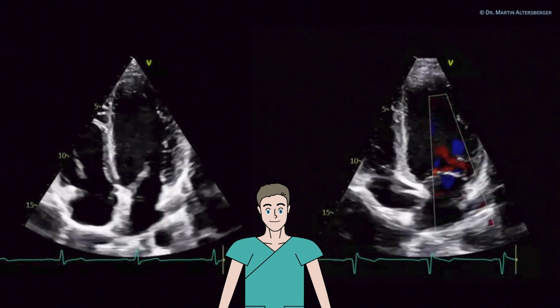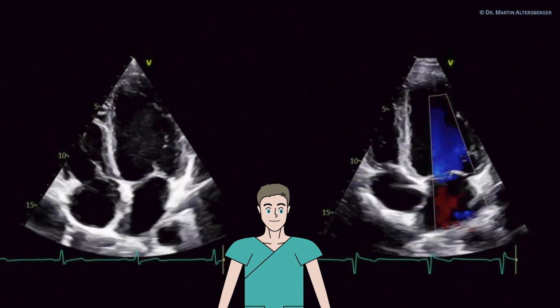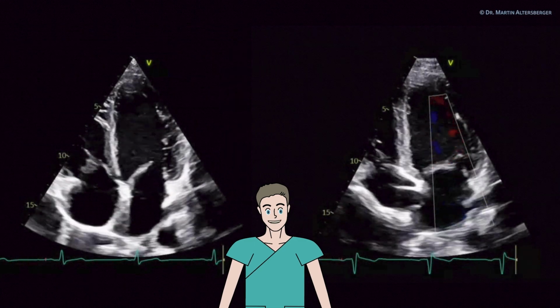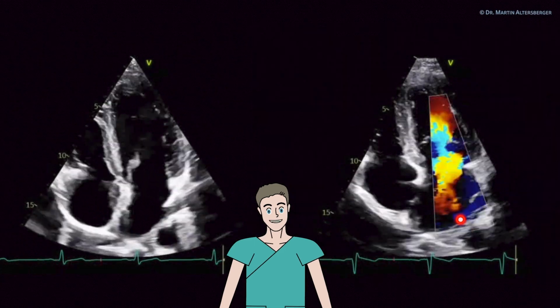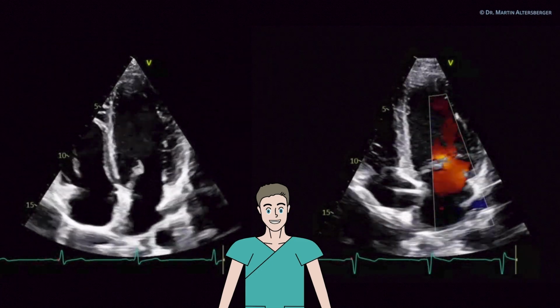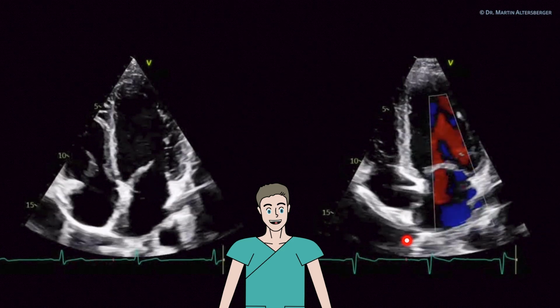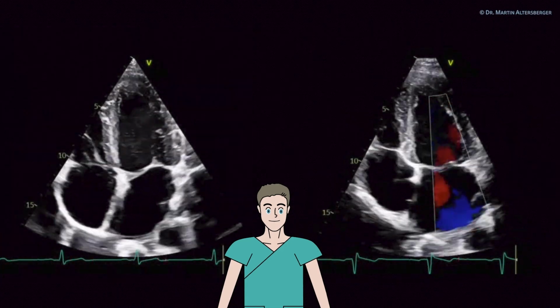So if you do that, you see here a vascular structure. Here's another structure, but that might be the left atrial appendage. But in this case, with color Doppler, we do see that there is flow coming into the left atrium. Here you see the blood flow. Of course, this is not optimal for Doppler measurements. So we have to find another structure that must be the right upper pulmonary vein.